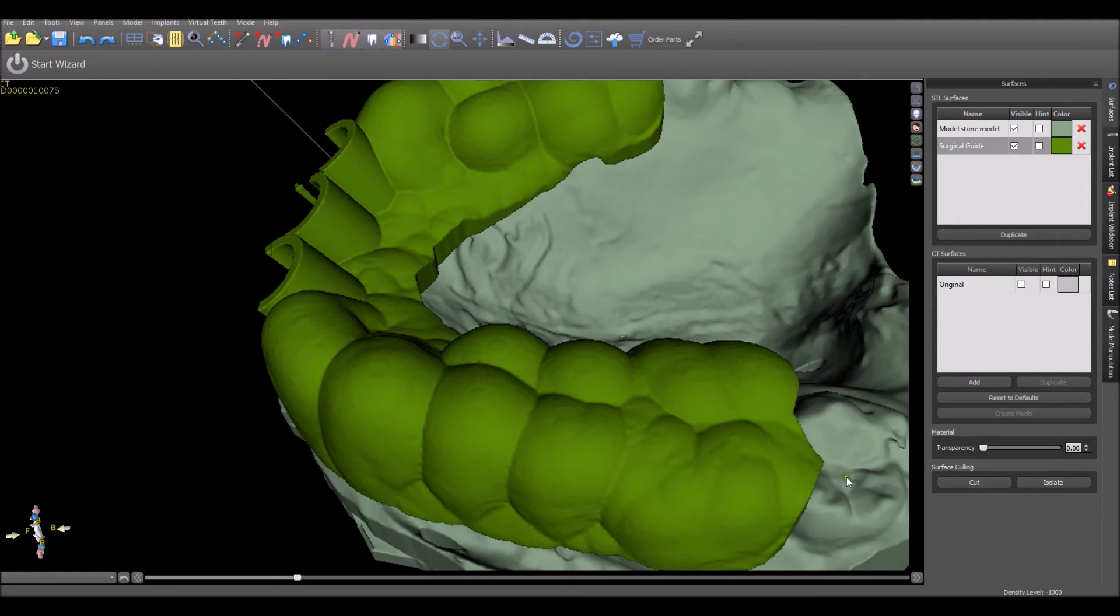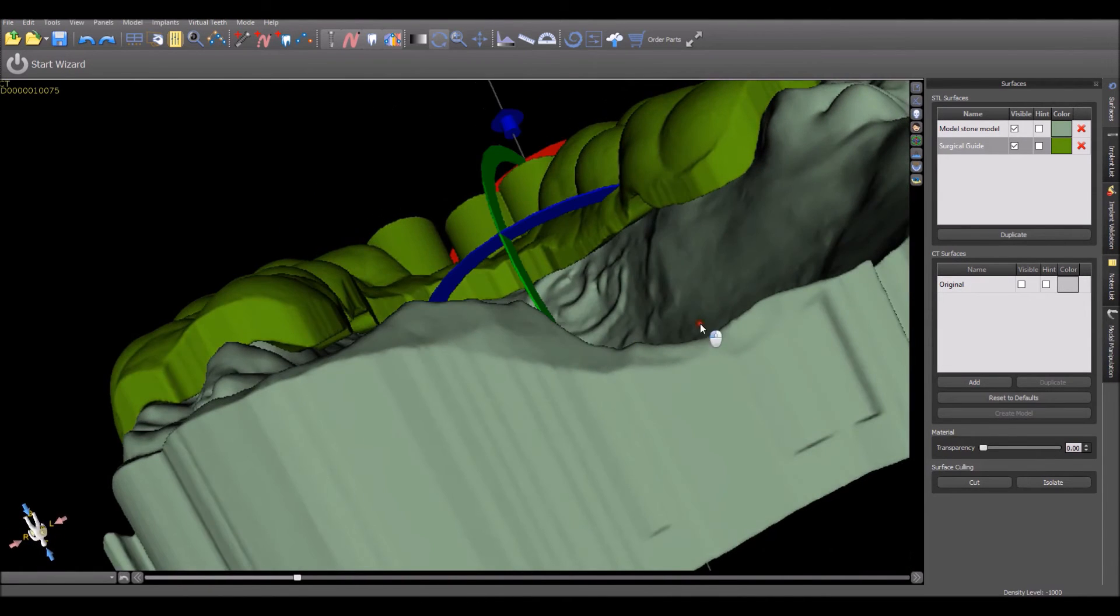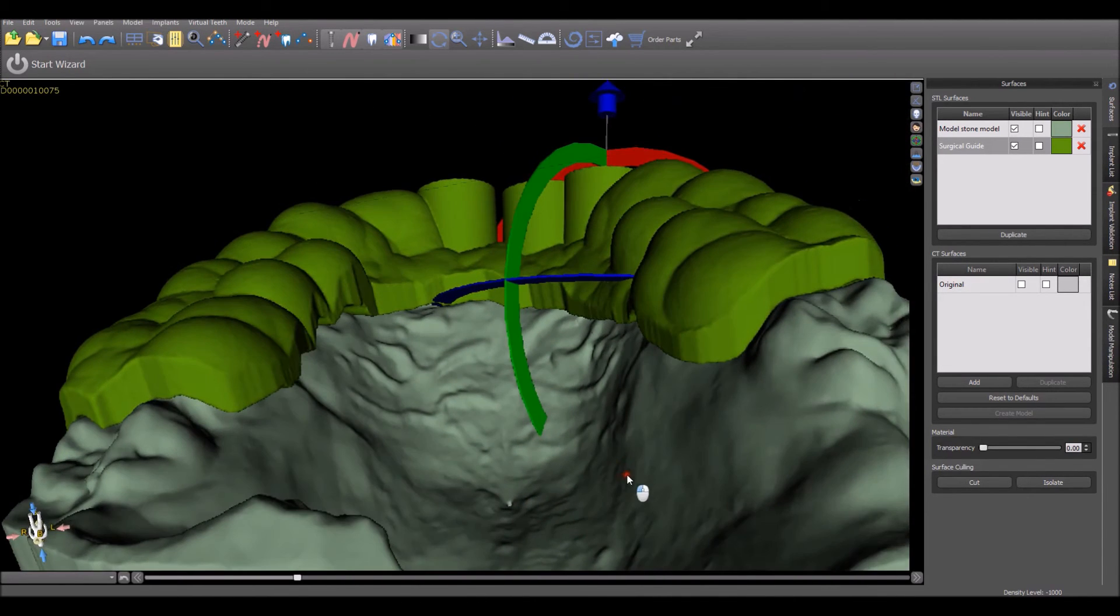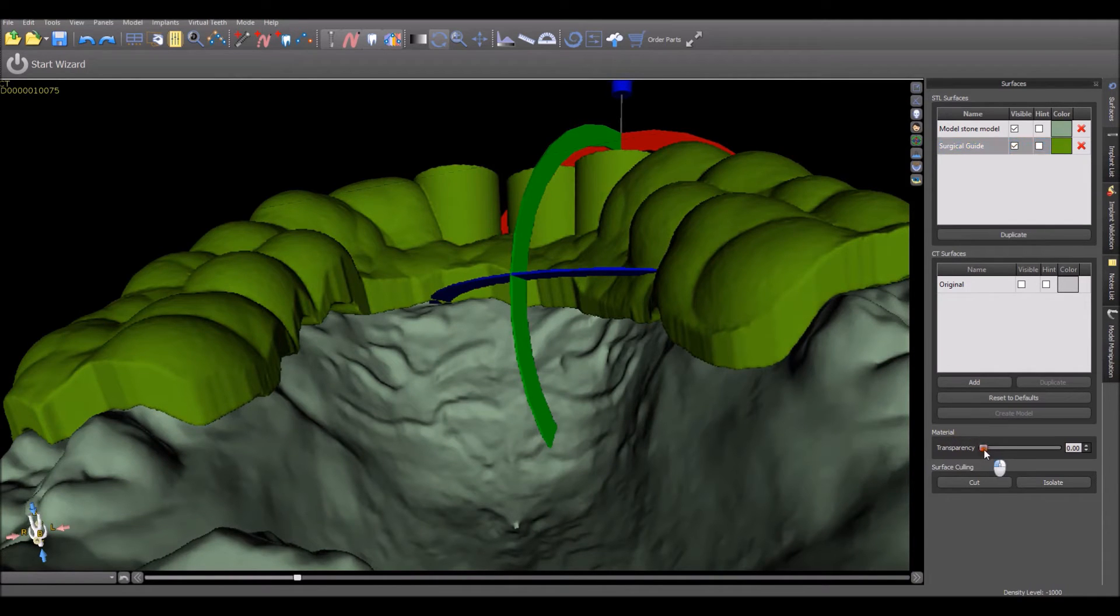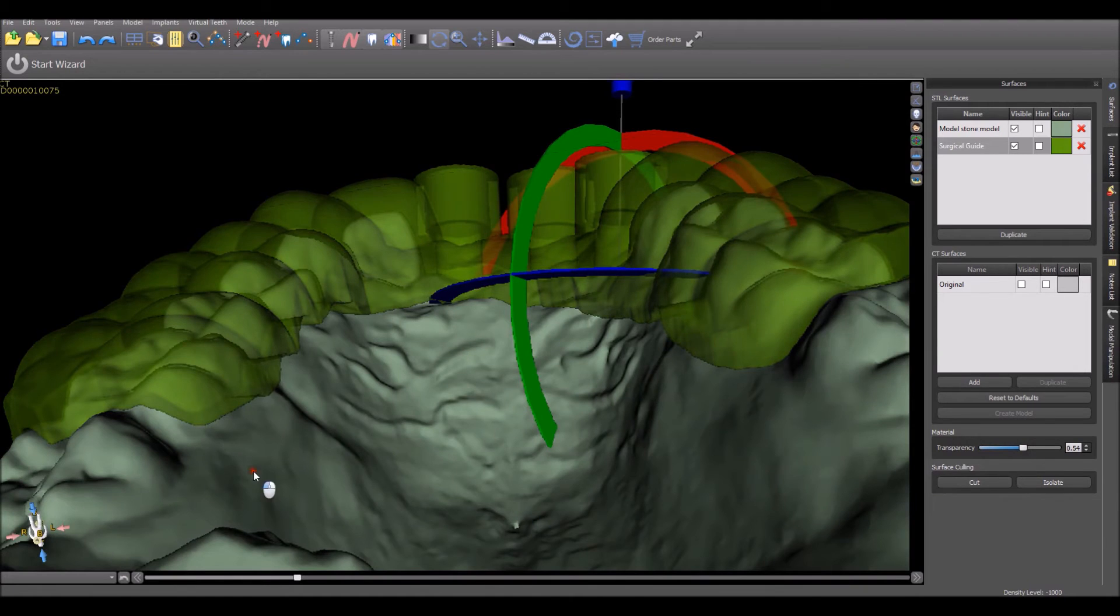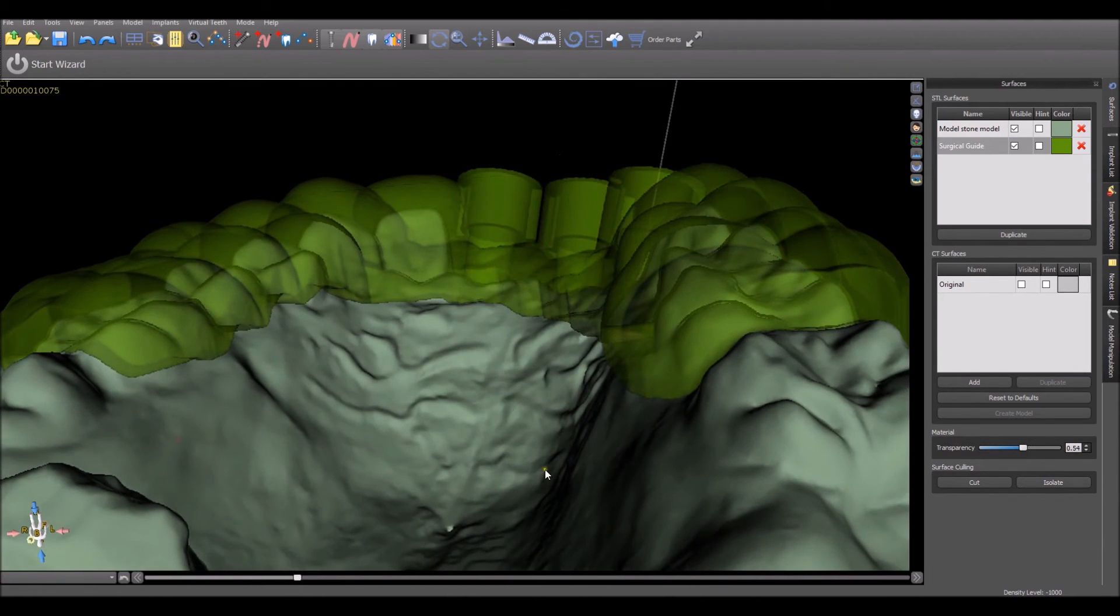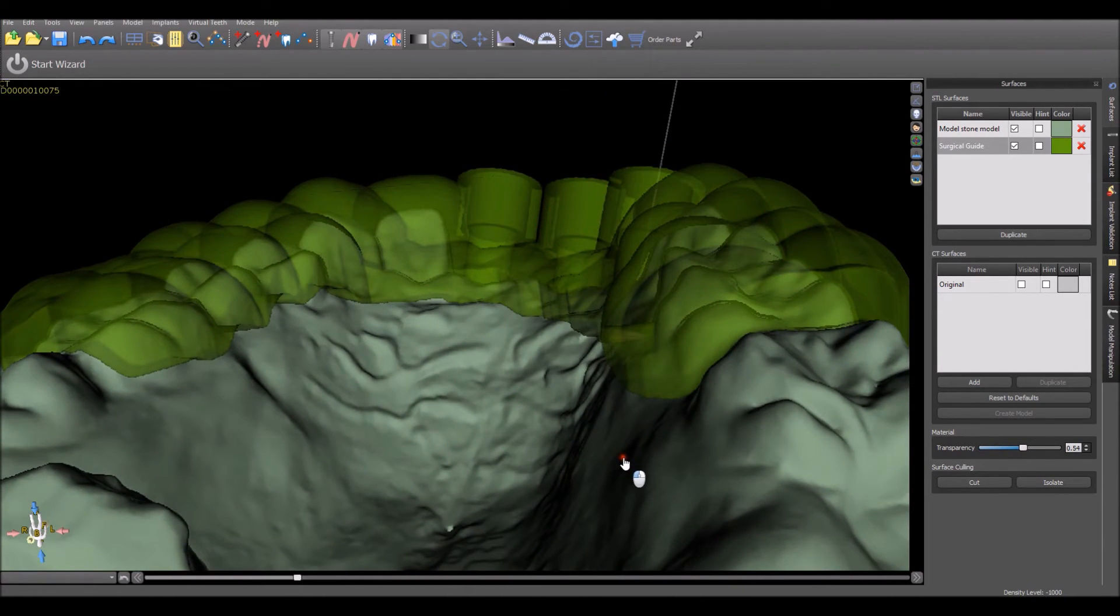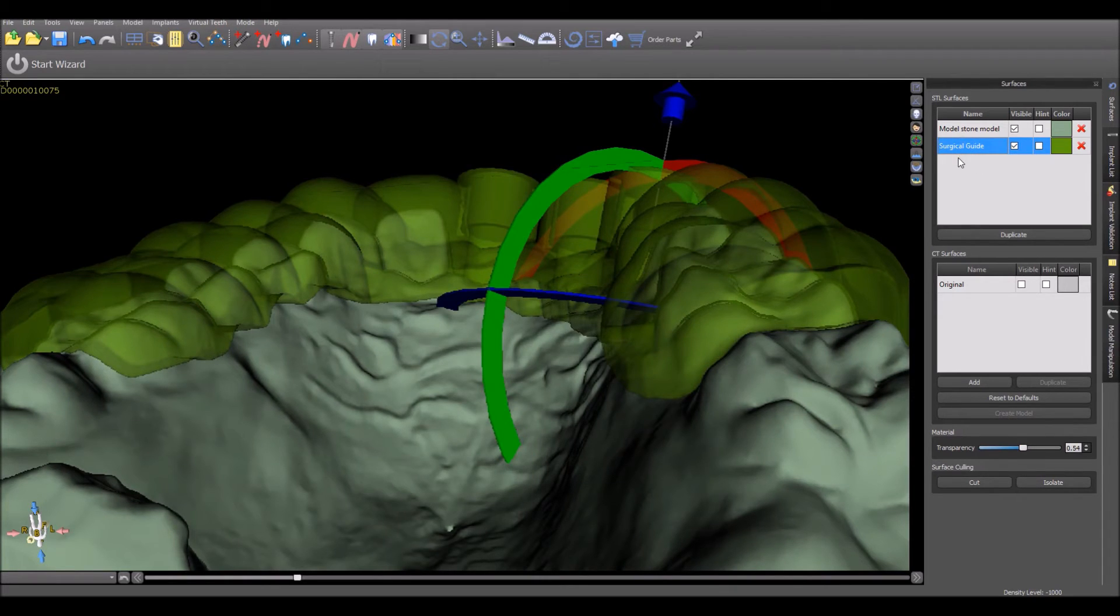A better approach is to cut from the inside out. First of all, you can raise the transparency of what you would like to cut on the surgical guide. Of course, always make sure that you have the correct surface active so that you are cutting the correct surface.